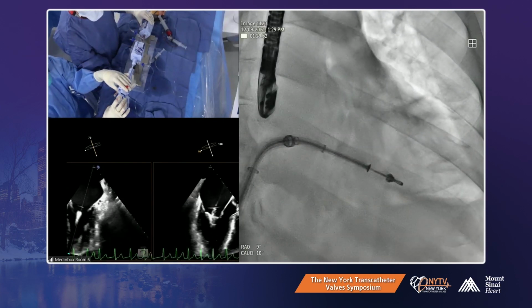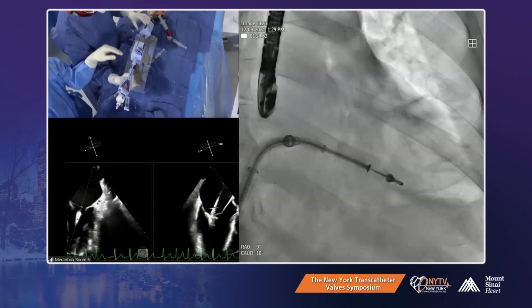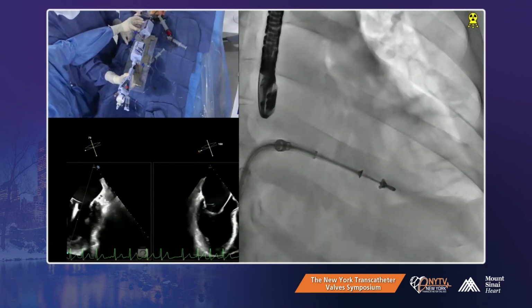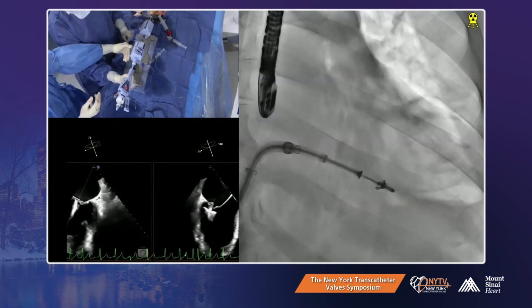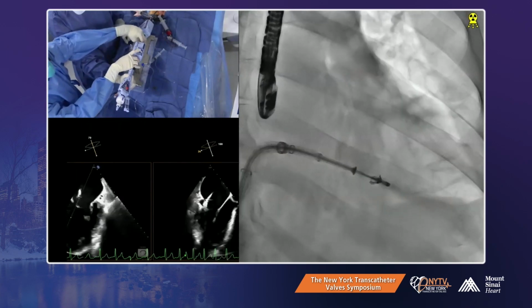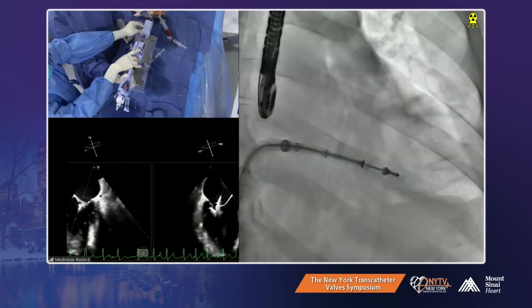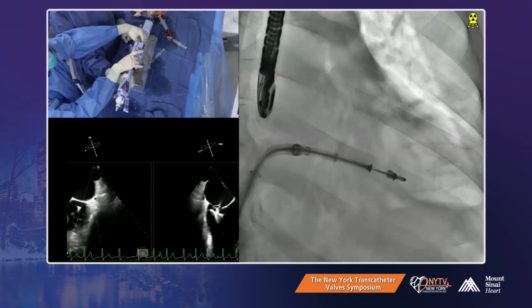What do you think about adding a tiny bit of plus? We have had a lot of plus already. We can go even 2,000 more. Okay. No, lost anterior. It's stuck, I think, because of the plus. Now I think you're really out of plane with that plus. Totally disoriented. So let's try to do 3D again just to make sure.